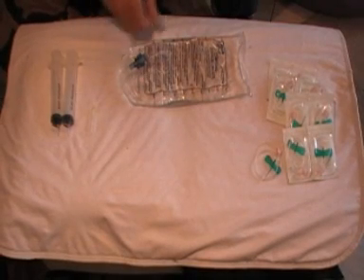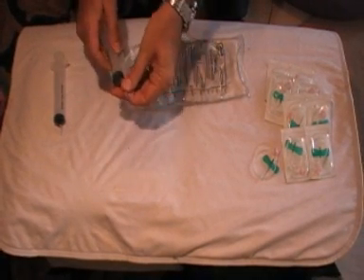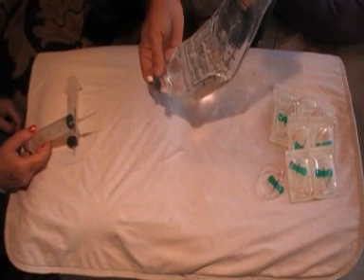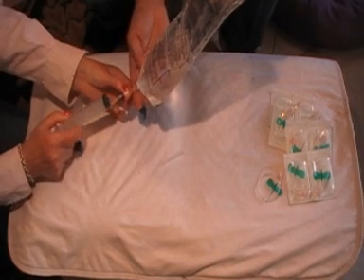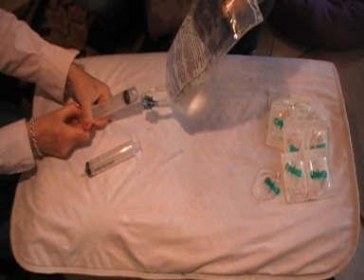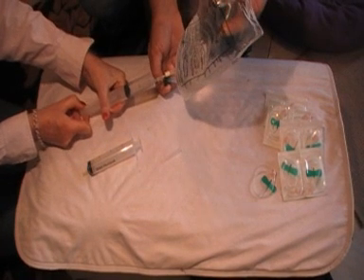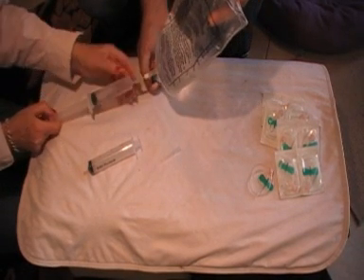In this section we're going to show you how to draw the fluids from the bag using the needle and syringe for the fluid therapy. Using gravity — and maybe you need someone else to help you — to draw the fluids out using the port there; it's a one-way valve. Just drawing it out slowly; there is a bit of pressure there. You'd fill both syringes up, or as many as you need to perform that therapy.